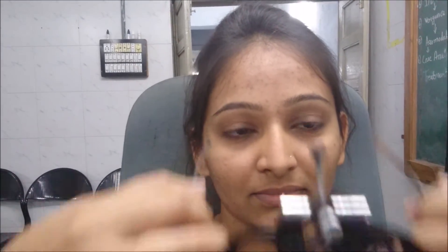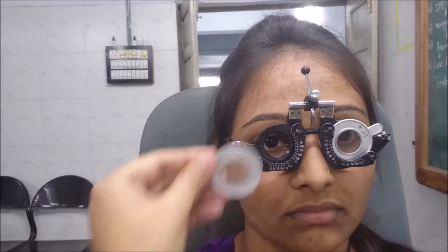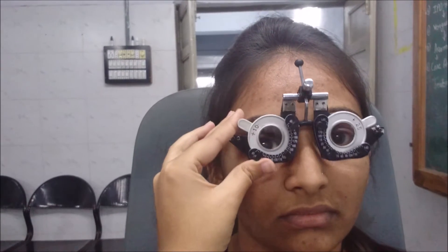The menace reflex is positive in this patient. Another test involves placing a low convex lens in front of the malingering eye and a high convex lens in front of the good eye, then asking the patient to read.